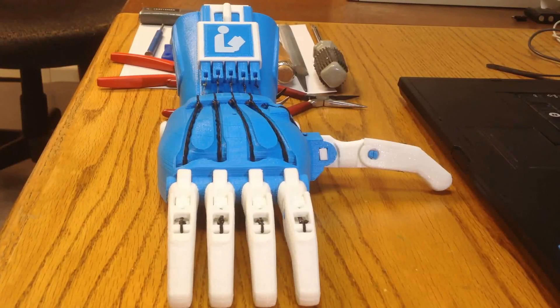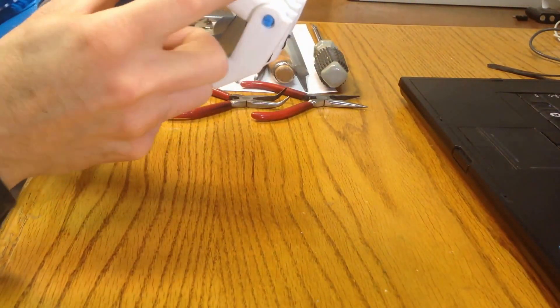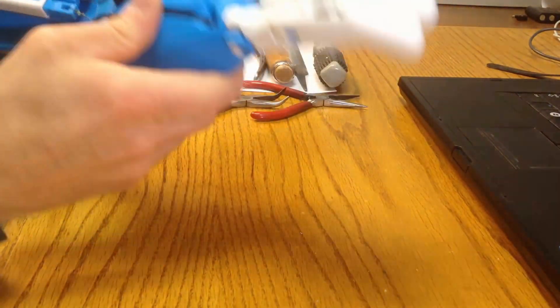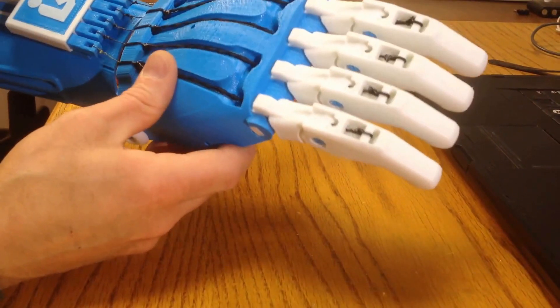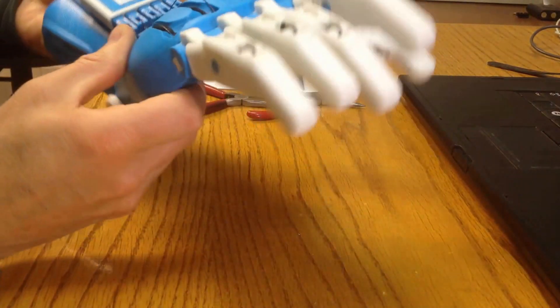I'm going to show you how I address a problem which is not uncommon with the Raptor and Raptor Reloaded, and possibly even the Phoenix-designed hands. Once they've been strung up, there can be problems with excessive friction in parts of the finger mechanism, which means that they don't operate cleanly. Here's an example of a Raptor Reloaded that I've just finished stringing up. Although it looks clean, in reality when I try and operate it, the proximals don't all bend down as you would like, including the thumb. A slow closing of the hand will show that it really isn't operating very cleanly. This is going to need some attention.